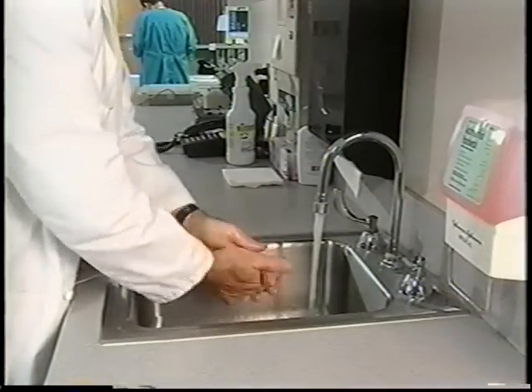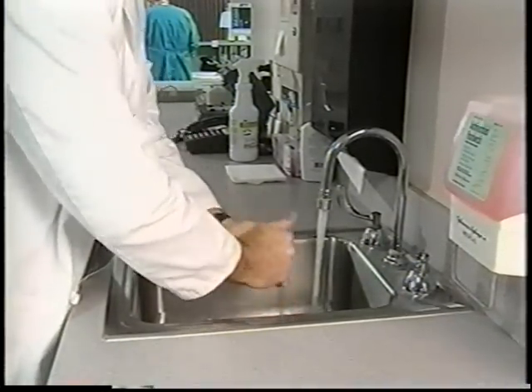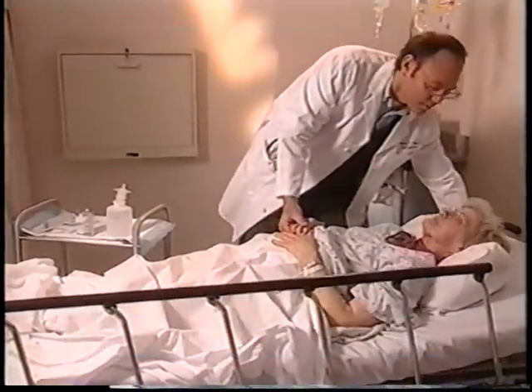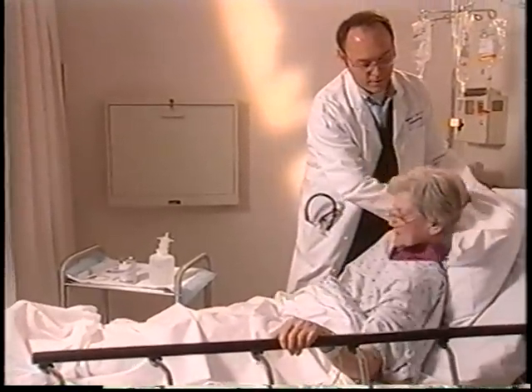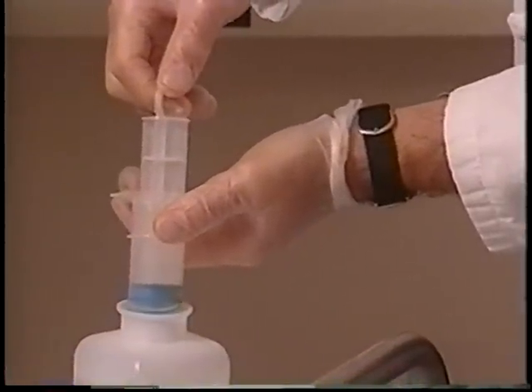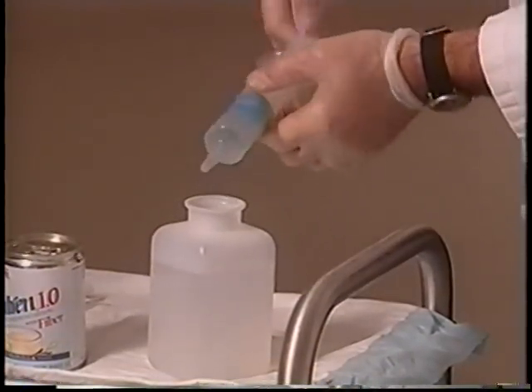In preparation for feeding the patient, proper hand washing should be completed. Before the formula is administered, the patient should be in a sitting position or have the head of the bed elevated at least 30 degrees. Then, proper tube placement must be confirmed. To do this, 5 to 10 milliliters of water should be drawn into a syringe. If the patient is a child, 3 to 5 milliliters of water should be used.